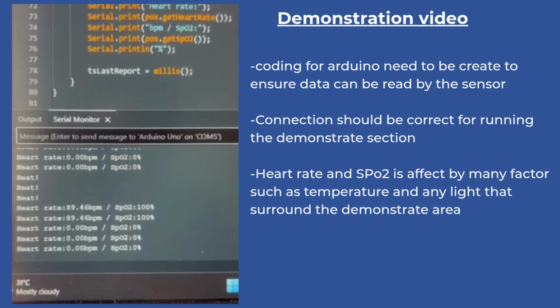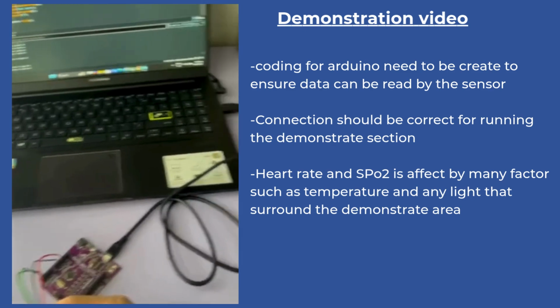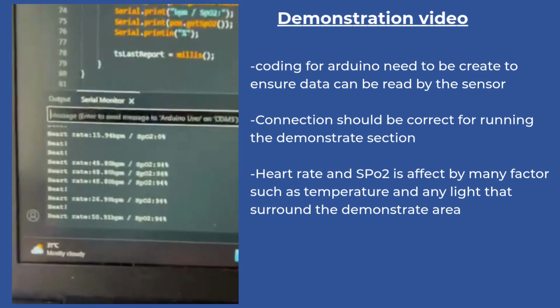So this is a simple demonstration from our group, where we put our finger inside here and connect to here, and then the data is monitored on our laptop.